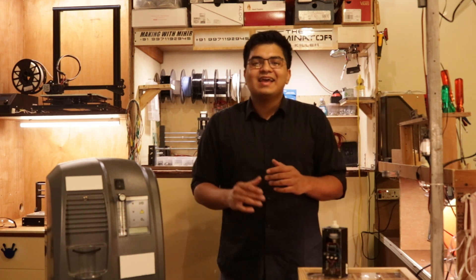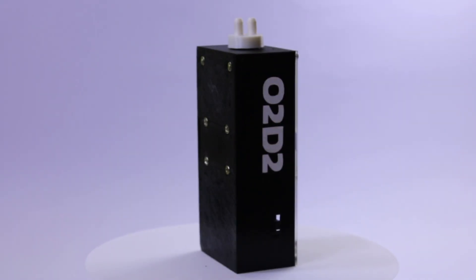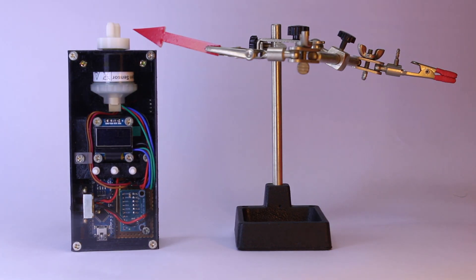The wiring inside, which I think is pretty neat, is all done through standardized connectors and a single PCB. The sensor has a fully 3D-printed enclosure with a power switch on the side, a removable battery compartment on the back, and a place to attach your oxygen lines to.